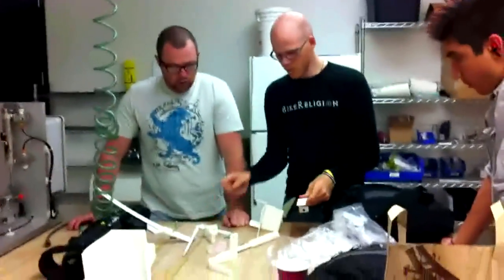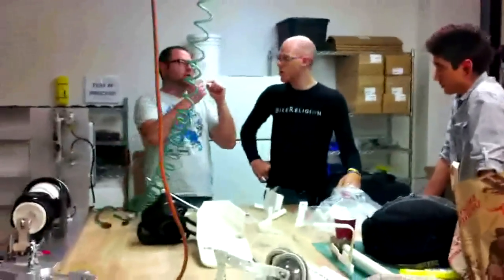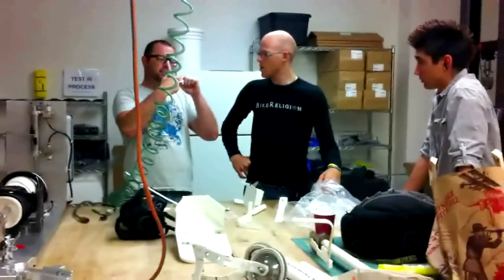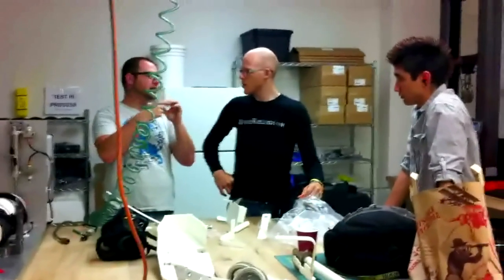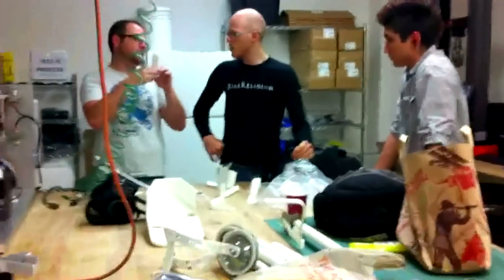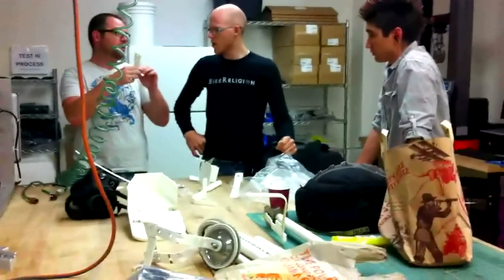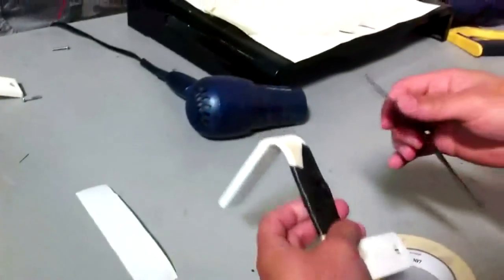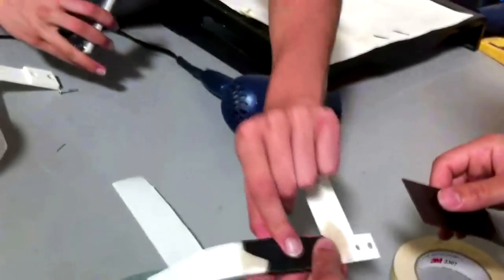Kyle, Brian, and Matt focused on the footrest and upper mounts of the device. Agreed concerns with our mentor Adam that the SLA parts were too weak led us to using carbon fiber overlaying in order to reinforce the parts.